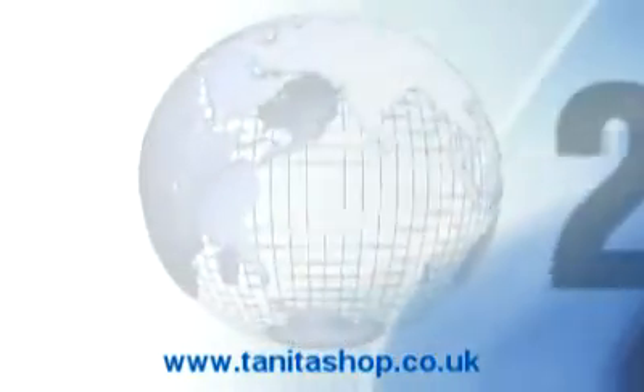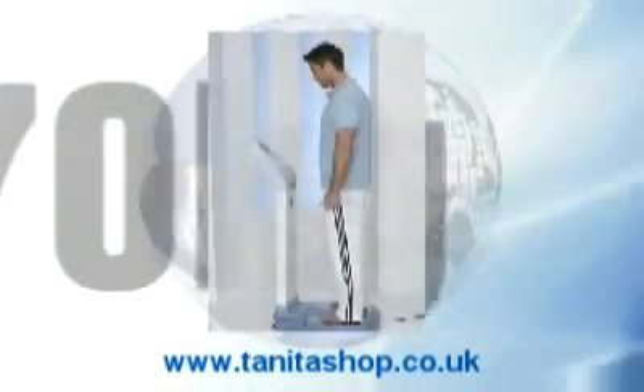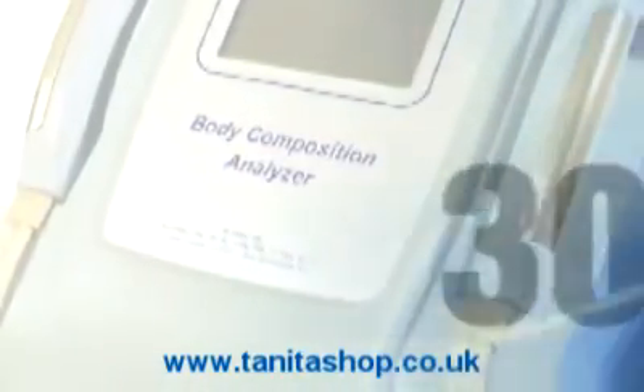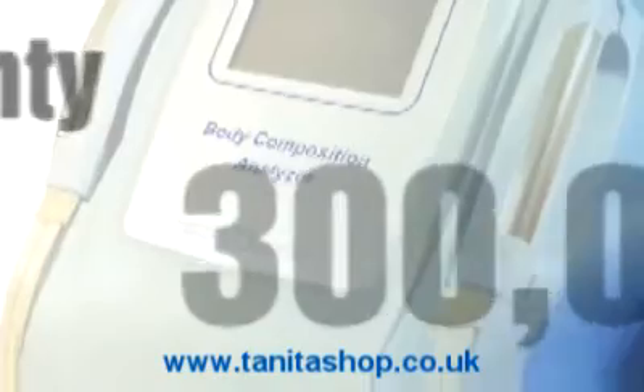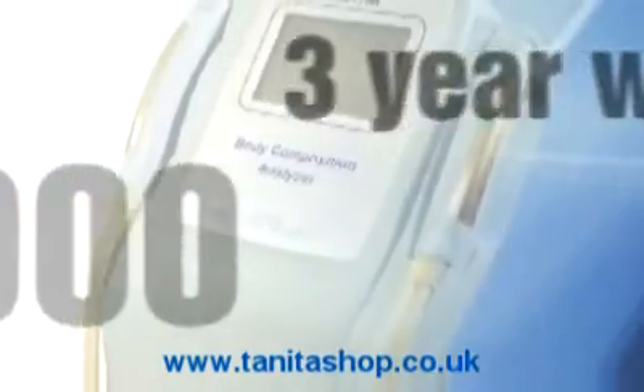With a high capacity of 270 kilograms, the MC180 is suitable for heavier clients within the healthcare and fitness fields. Calibrated up to 300,000 uses and backed by a 3-year warranty, the MC180 is robust and requires minimum maintenance.